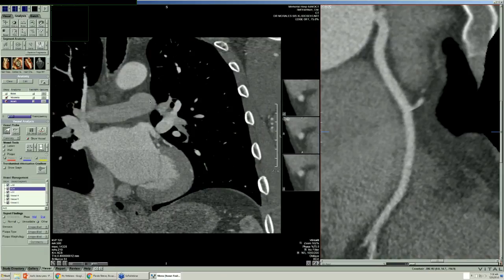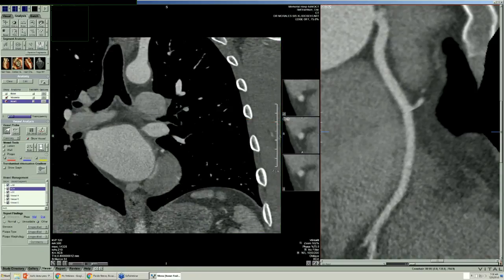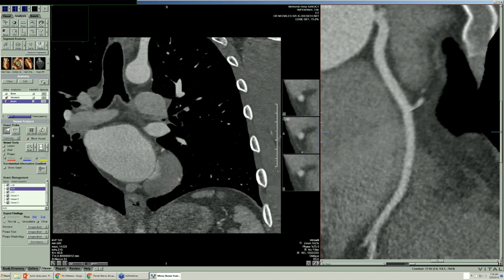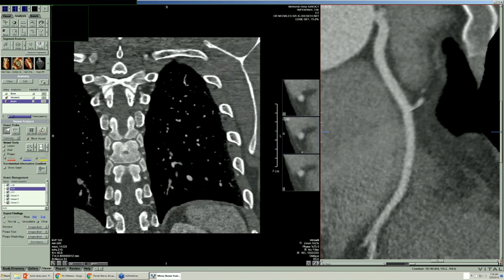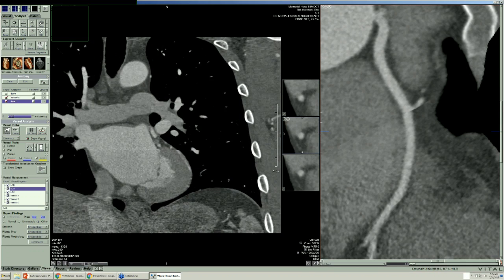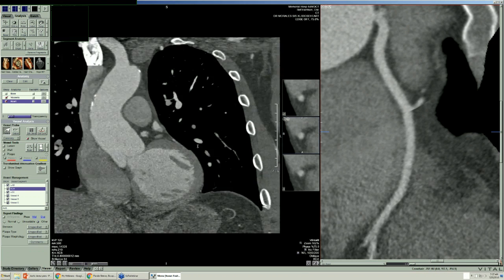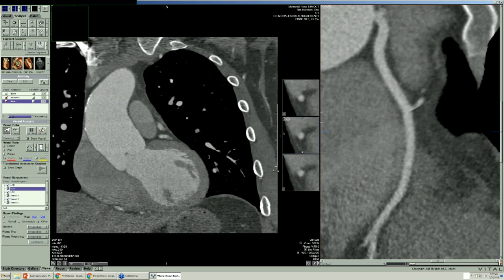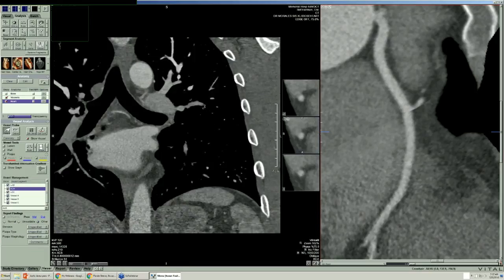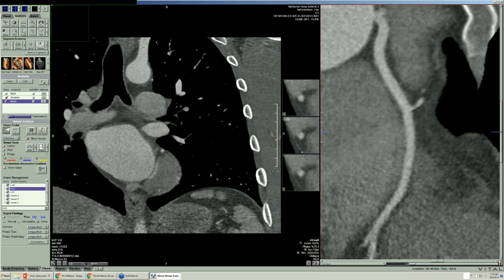And then he said, well, sometimes the catheter actually collapses inside because it won't kind of loop over. And he said, oh, yeah, I've got to change catheters. I'll get a bigger one. And he said sometimes people have to use a multi-purpose, and they have to get a longer catheter, 125 centimeter instead of 110 centimeter. Okay, I got it. And very frequently, the cardiologist would just give up because he can't reach the vessel. David, I wish you would keep quiet during this procedure. And so the cardiologist did give up because he couldn't reach the coronaries.